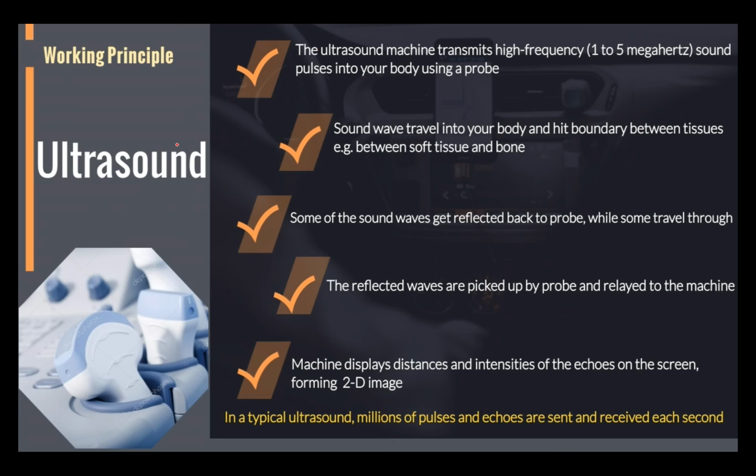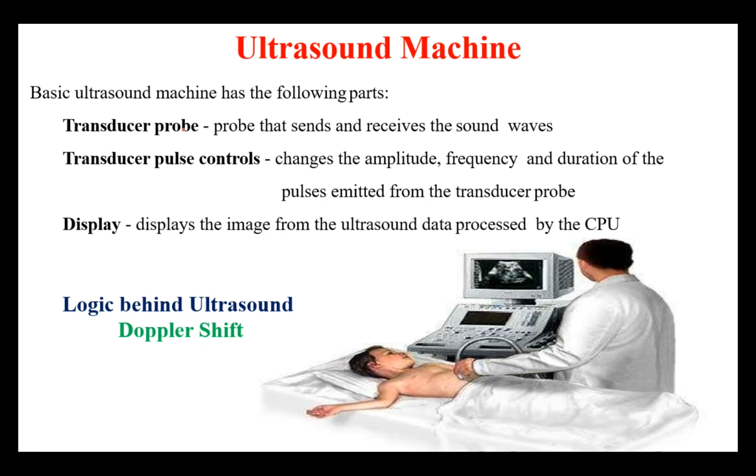First and foremost, if you take the typical ultrasound machine, the patient will lie down on the patient bed. We have transducers here, and they will start focusing on the area of interest to image, in the kidney region or the abdominal region.